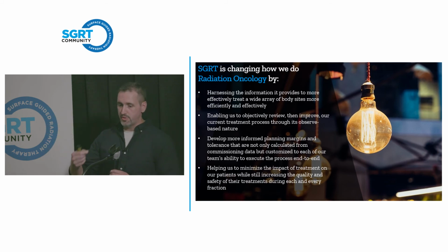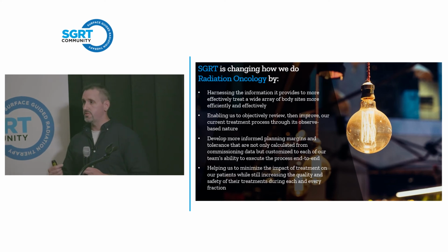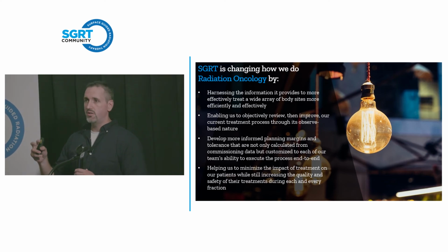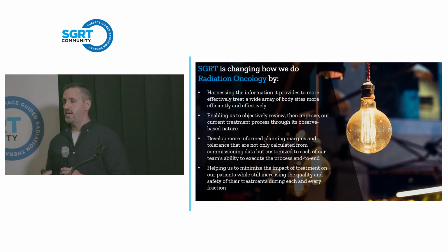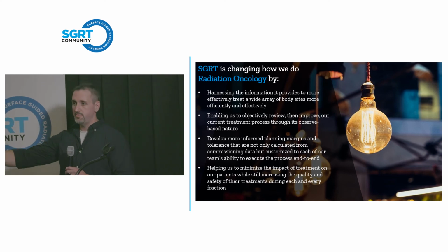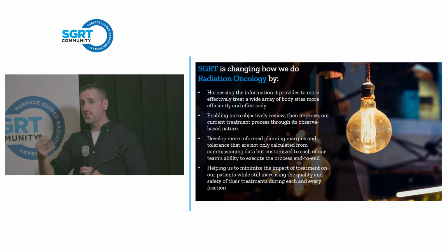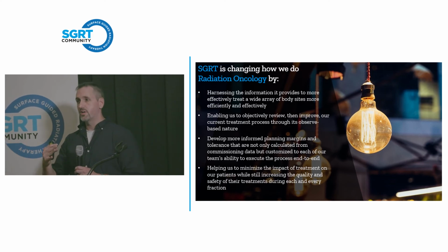So going into the next point, to develop some more informed planning margins for our dosimetrists, but also we can evaluate an end-to-end plan or staff quality metric where if we're delivering, say, DIBH at one institution and we bring on DIBH at another institution, we have an objective way to compare how DIBH is going between the two institutions. Are we delivering the same standard of care, or do we have some variability across institutions?